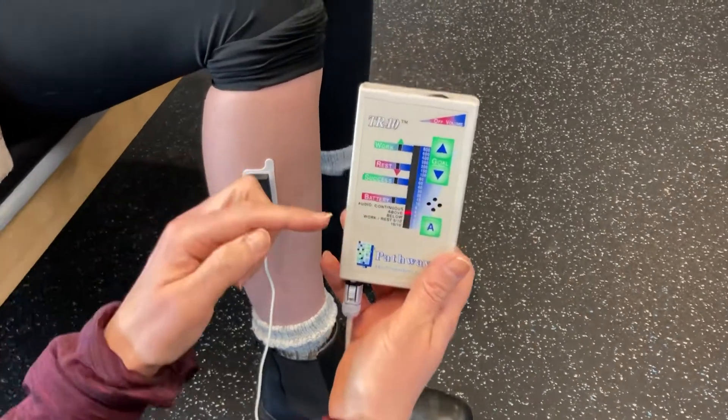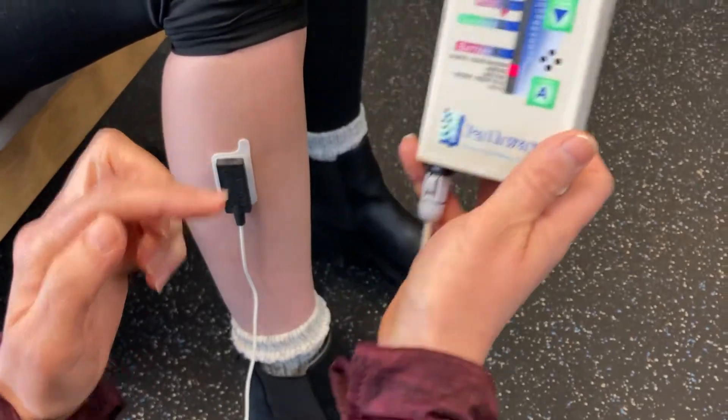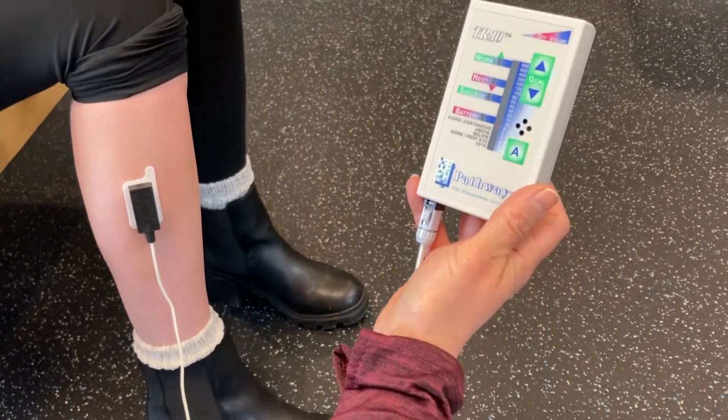What we can do is have Sassy hold this and watch it, and she can set a goal — squeeze as hard as you can — and she's going to try to get it as high as she can, and then let that muscle relax down.